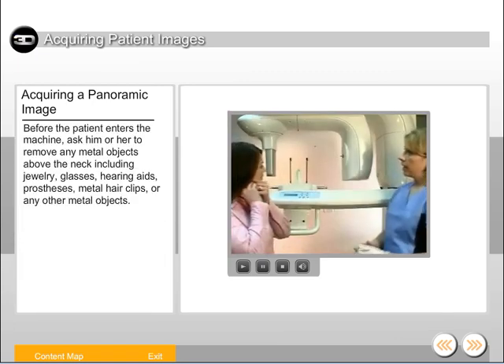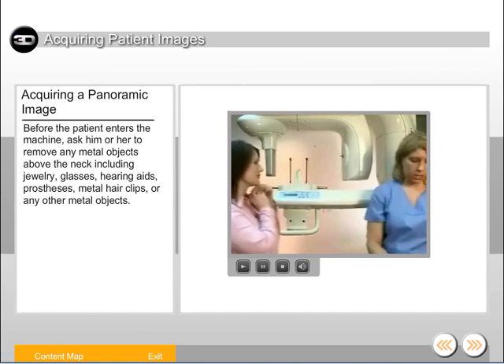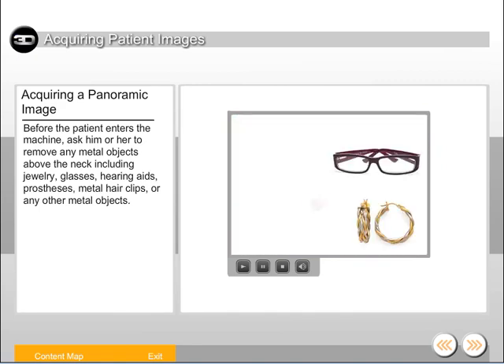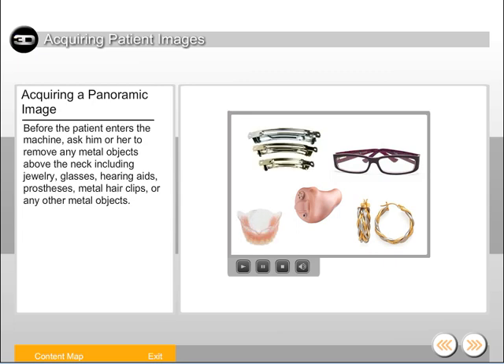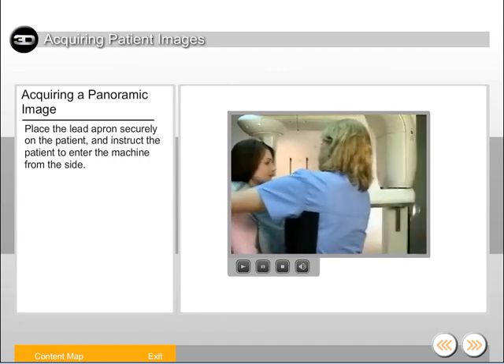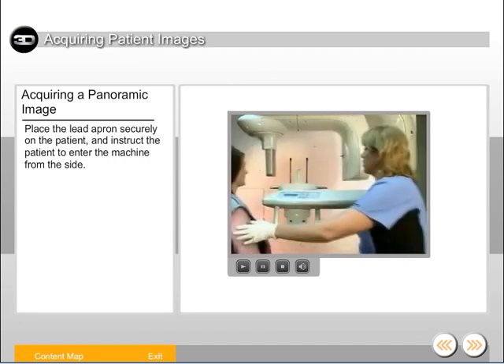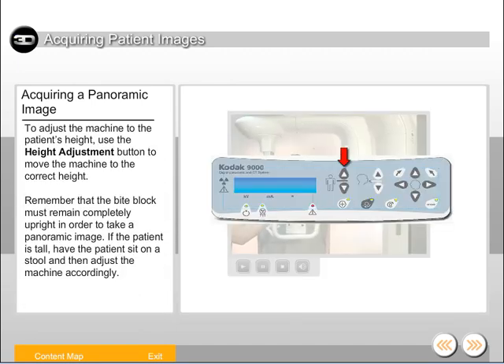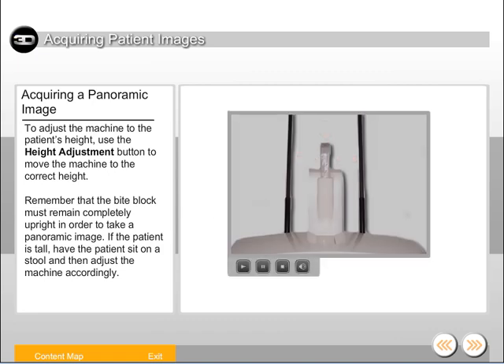Before the patient enters the machine, ask him or her to remove any metal objects above the neck, including jewelry, glasses, hearing aids, prostheses, metal hair clips, or any other metal objects. Place the lead apron securely on the patient and instruct the patient to enter the machine from the side. Use the height adjustment button to move the machine to the correct height. Remember that the bite block must remain completely upright in order to take a panoramic image.